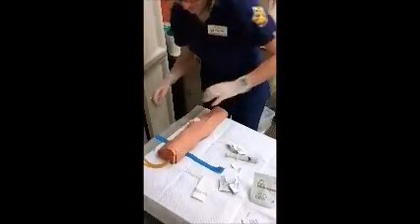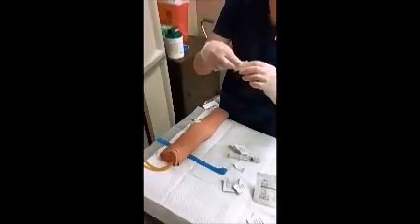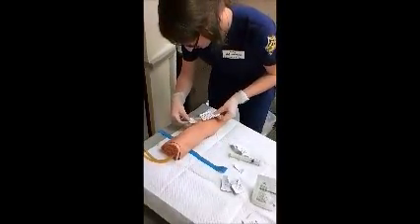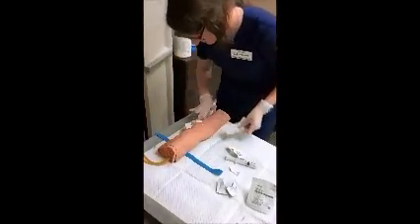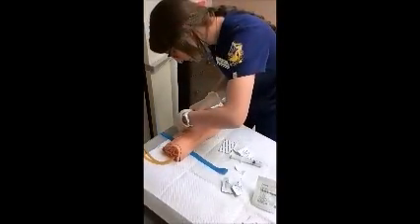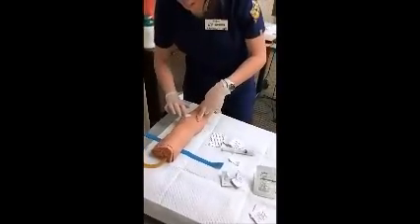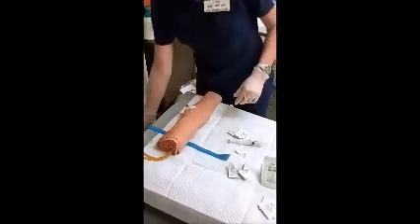Okay. Then we have our previously labeled Tegaderm with the date and the patient's initials and my initials and the time that I put it on. So we'll just go right over like so with that. Making sure all that's visible. We can still see that catheter tip in there, so we know how our site's looking.